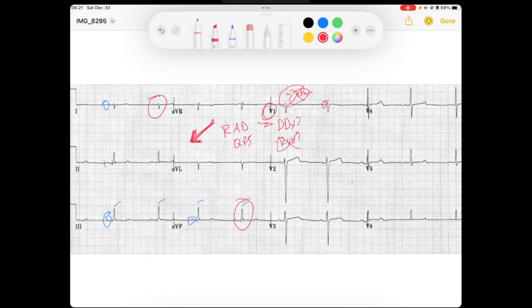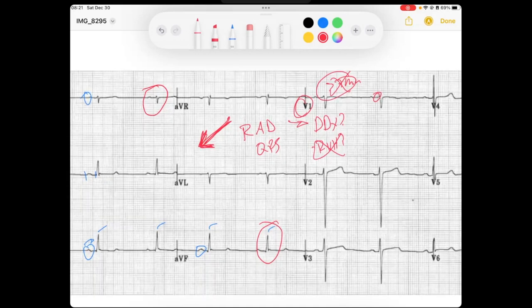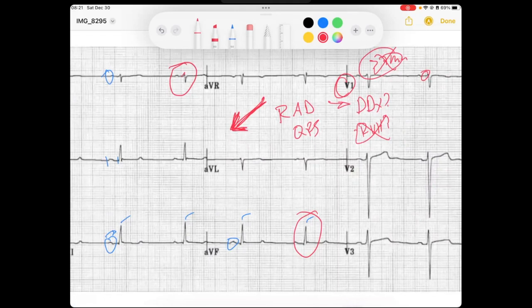Let's maybe look at fascicular blocks. And so when I look at lead 1, I see I've got these small R waves, which represents the depolarization that is being caused by our left anterior fascicle, which is healthy in this case. So we said that that creates small lateral R waves in 1 and AVL.